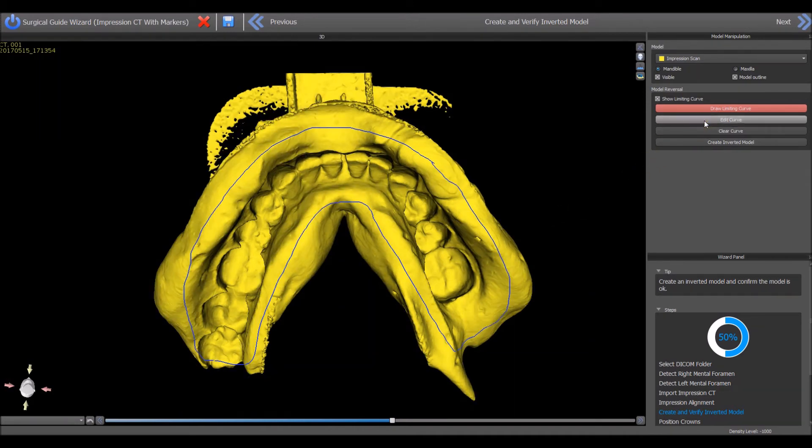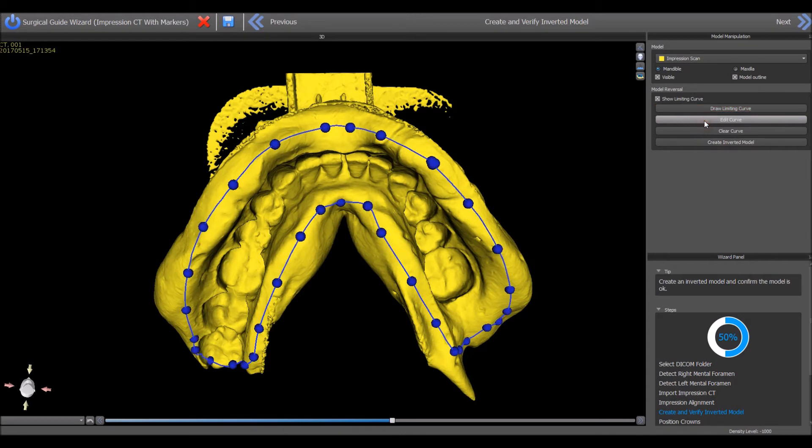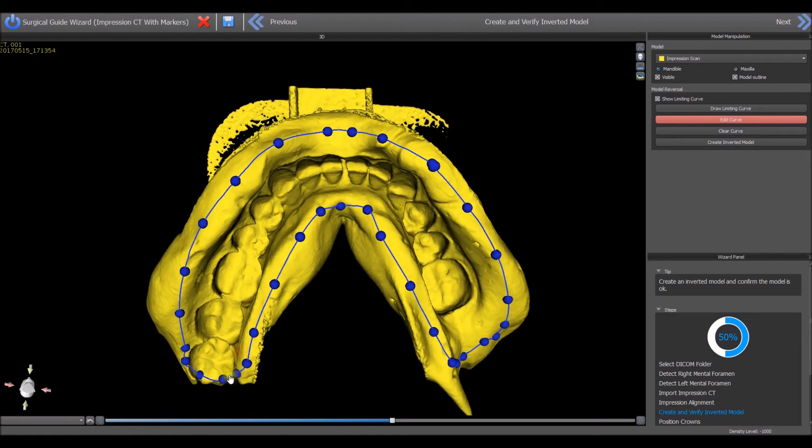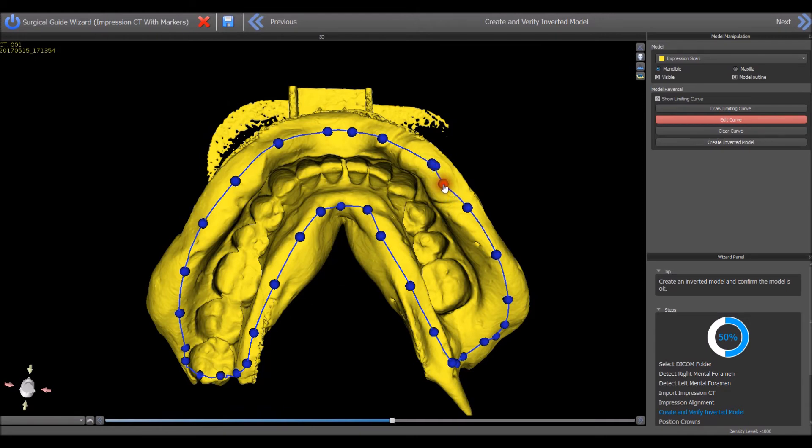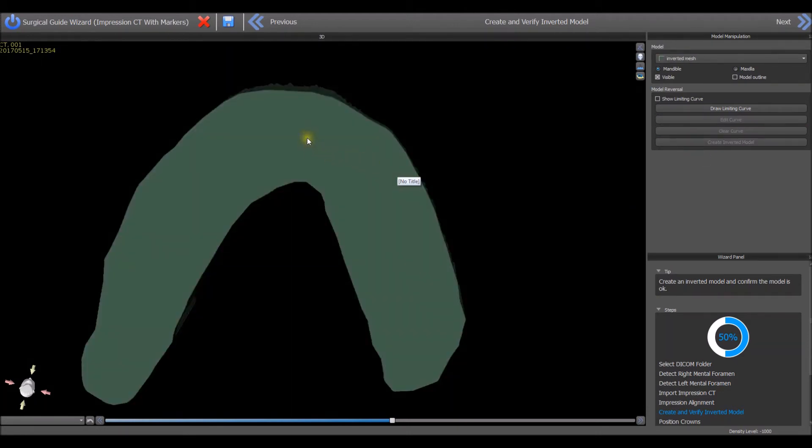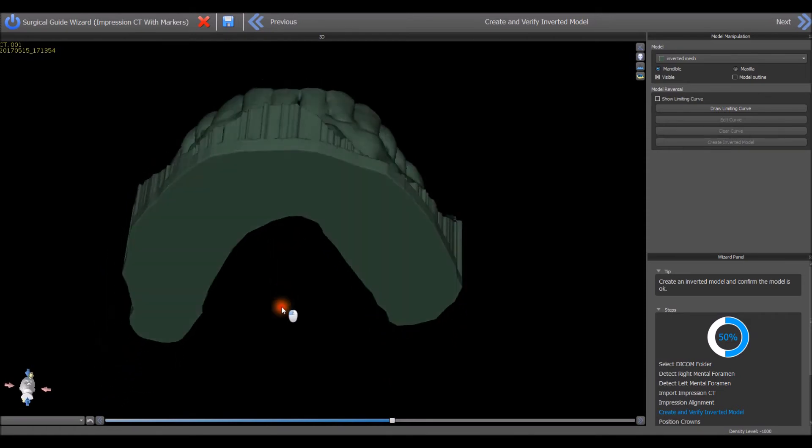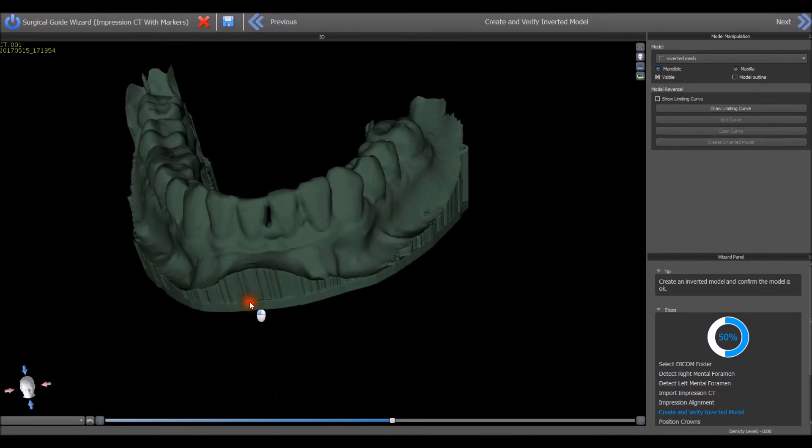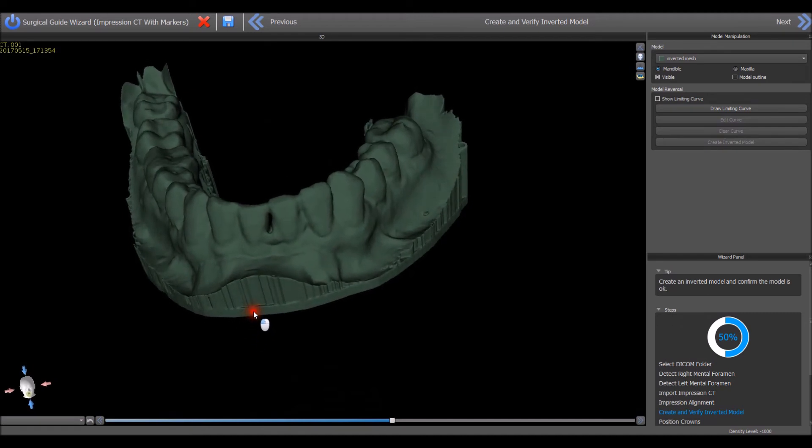Click the Edit Curve button. Fine-tune the placement of the curve by grabbing and dragging any of the nodes and to remove any crossed lines. Press the Create Inverted Model button. Hold the left mouse button and move the mouse to grab and rotate the digitally poured model to confirm proper model creation and then press the Next button.